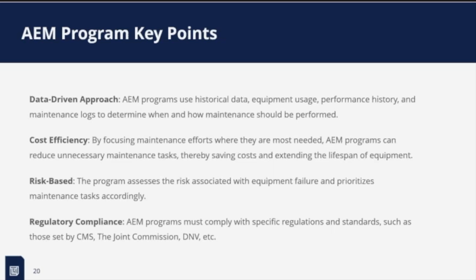You don't have that choice with some medical equipment, but as you're spending lots of money, people are expensive, their labor hours are expensive. If you're trying to meet that 100% requirement of completion, doing all OEM, it's probably going to be more expensive than if you're doing that with AEM. So cost is the main reason that the hospital is interested in doing that.